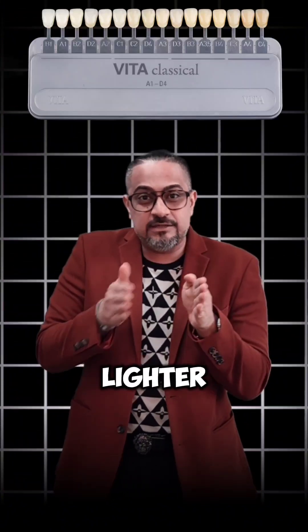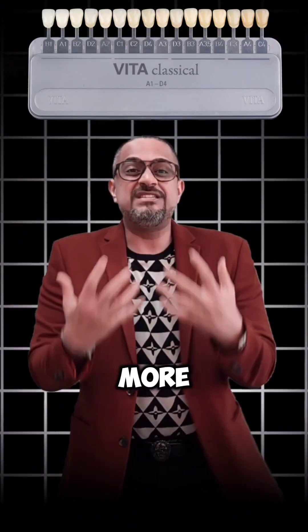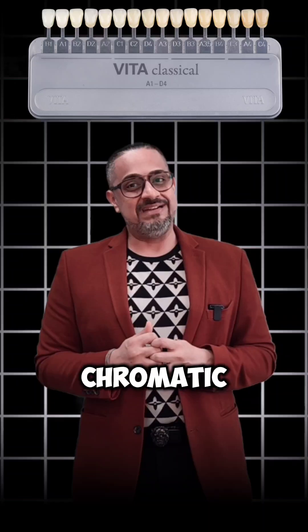When you talk about 1, 2, 3, and 4, you're going from a lighter tooth to a darker or more saturated or more chromatic tooth. Now the problem with the Vita Classic Shade Guide is that I have to choose the hue, chroma, and value all in one single step, which is very, very challenging.